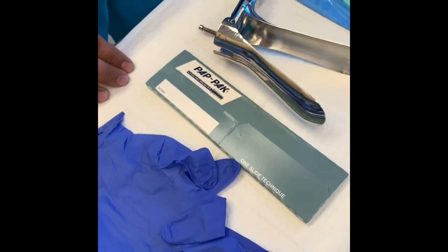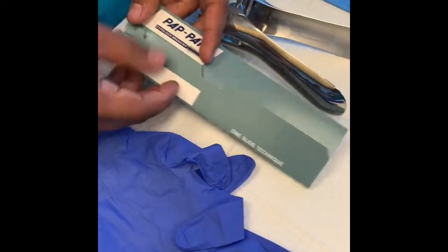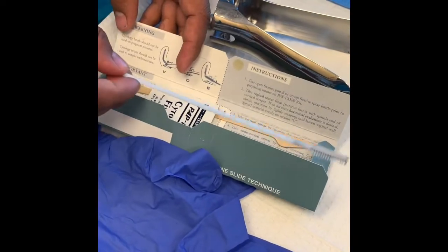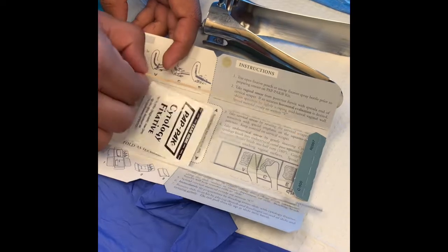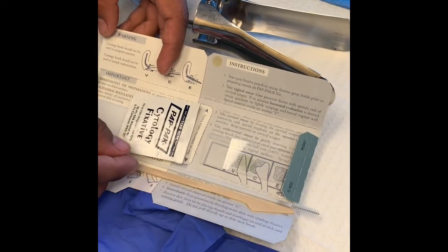The second thing you do need is going to be a pap smear kit, which includes the brush, which is this one right here, and the spatula, that helps to scrape the cells off the wall.